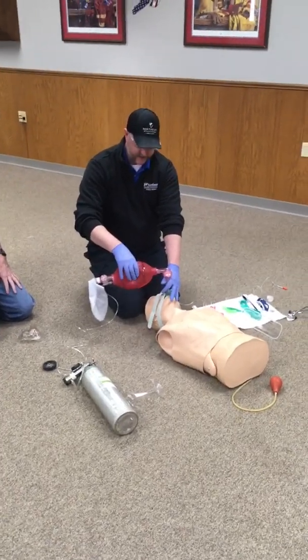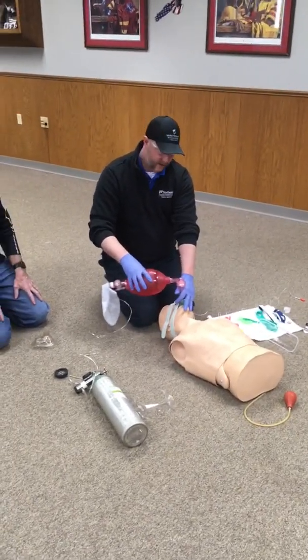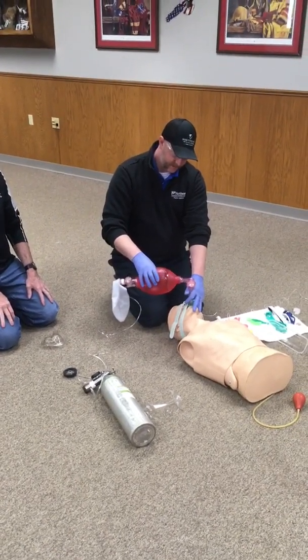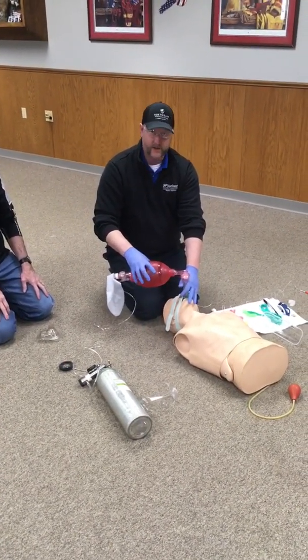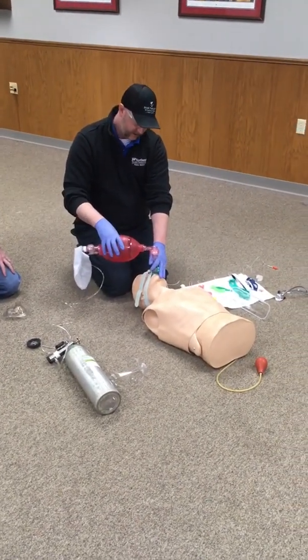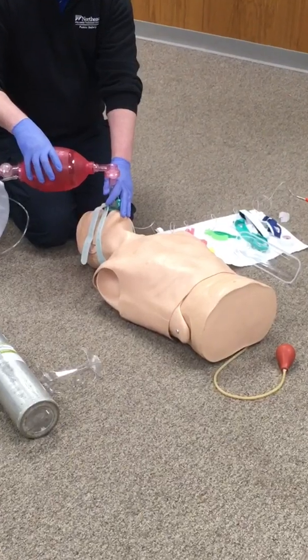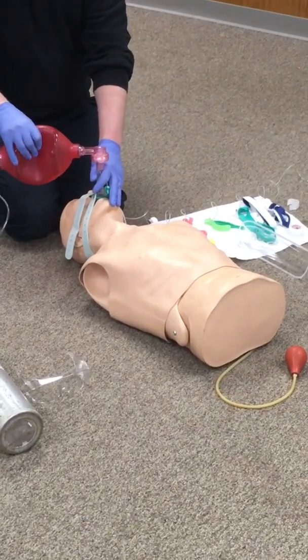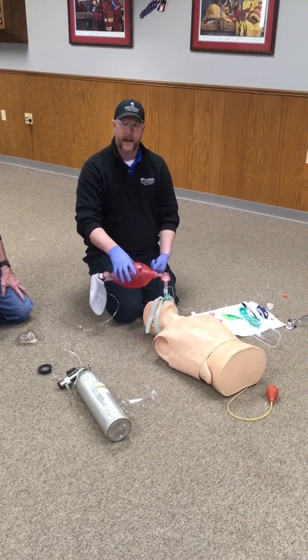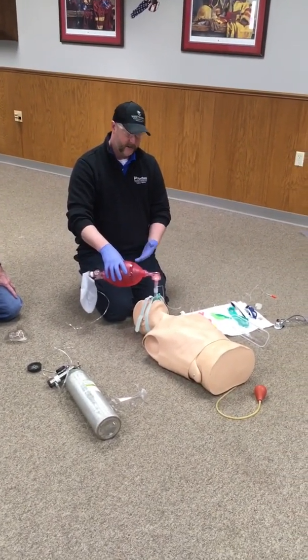Towards the end of the station, the examiner is going to ask you how do you know that you're giving adequate ventilations? The way that we determine adequate ventilations is that with each ventilation, I should see proper rise and fall of the chest. Once we've said that, we can go ahead and end the station, and that would be complete.